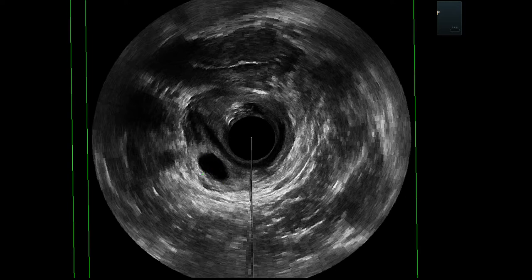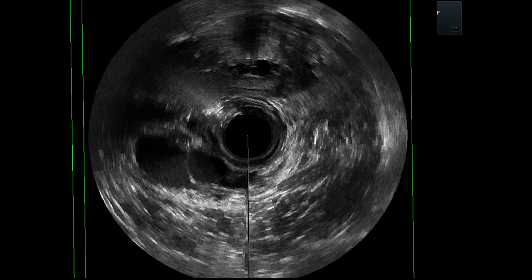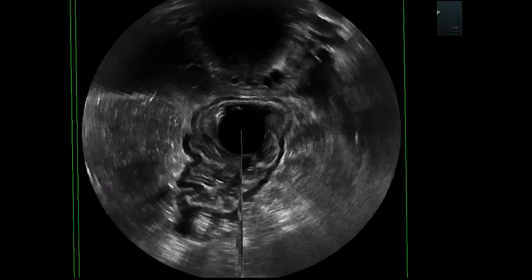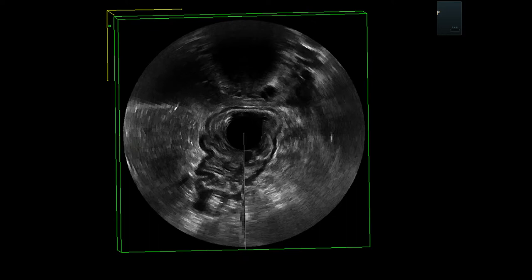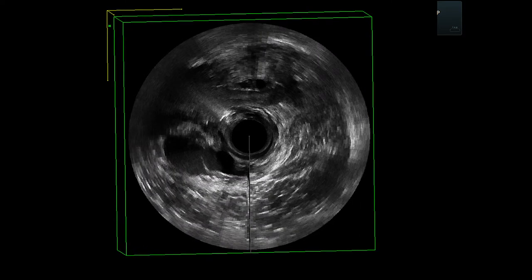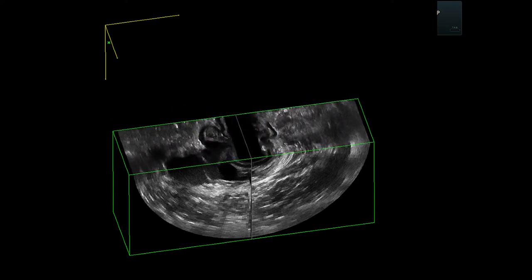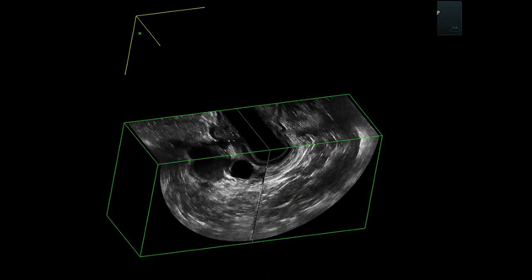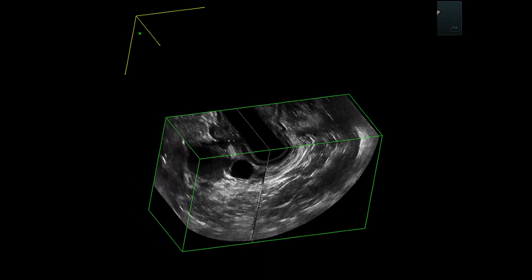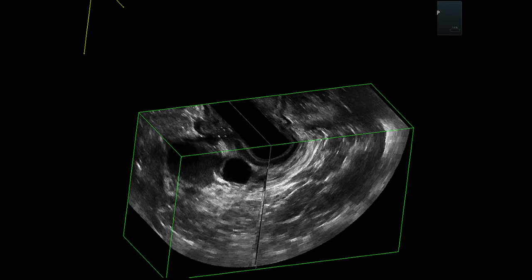And then we go higher up and look at the second lesion here. This is the second lesion. Okay. Let's go up. And then there is nothing more. Now, because we did the 3D, we can even manipulate our 3D volume in a very nice way. So I am working on the axial plane, but I can rotate the image on the coronal plane. And even I can go on the other sagittal plane.